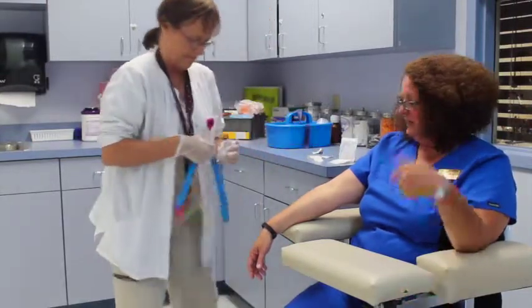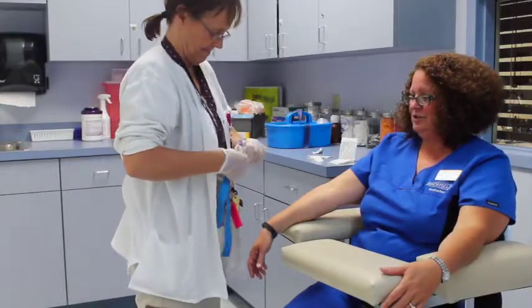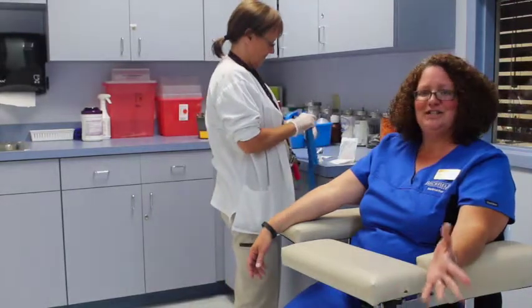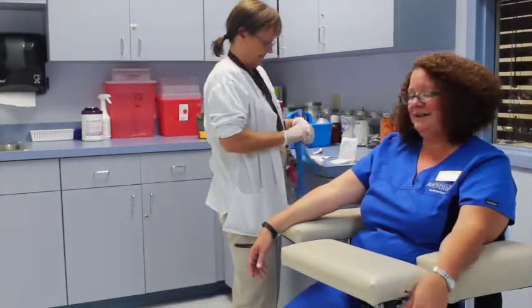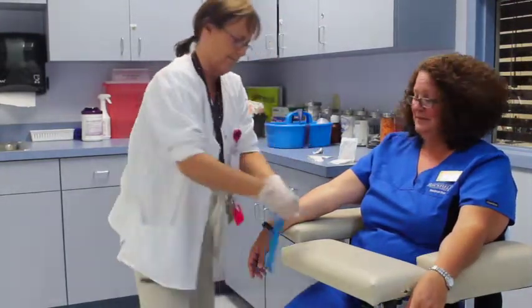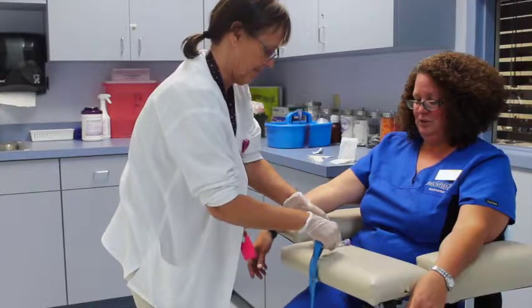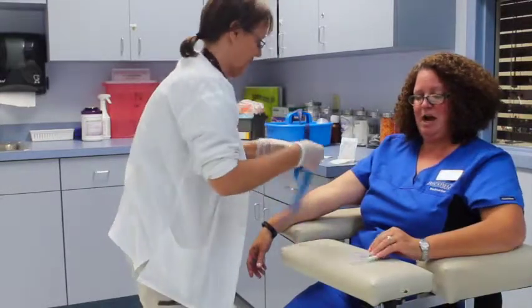Right now she's currently cleaned the site and she's going to assemble all of her supplies. As soon as she's done assembling the supplies, she will apply a tourniquet to my arm and she'll be ready to draw blood.